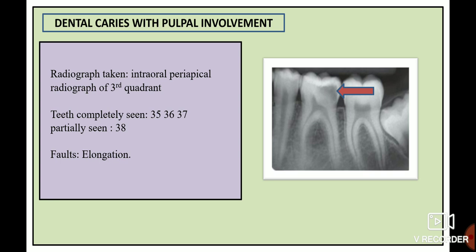Now let's discuss a radiograph showing dental caries with pulpal involvement. The teeth that are completely seen are 35, 36, and 37, and partially seen is 38. The trabeculae shows a step ladder pattern, which is a normal feature. The fault of the radiograph is elongation.